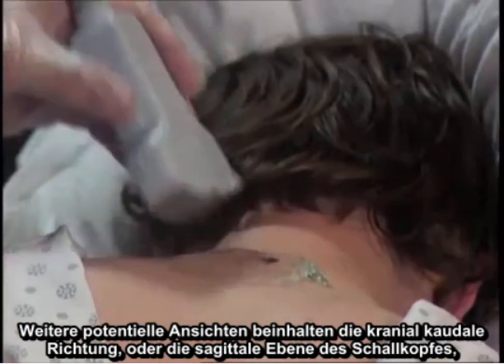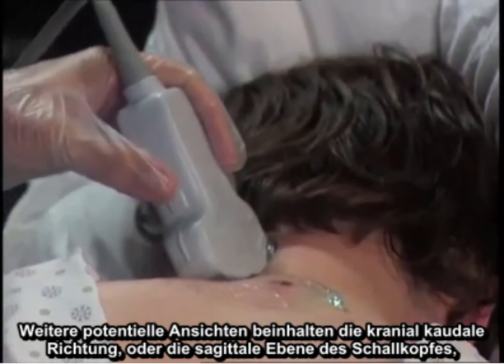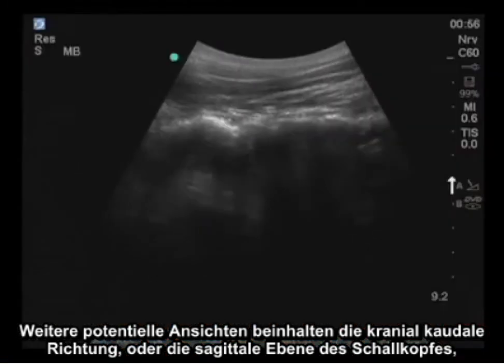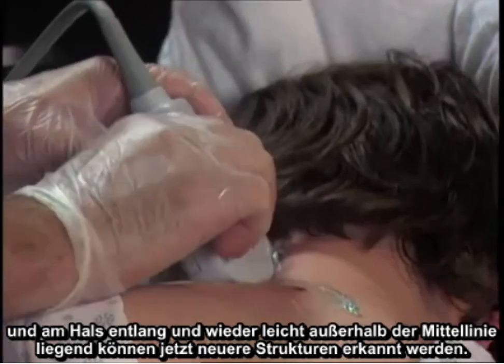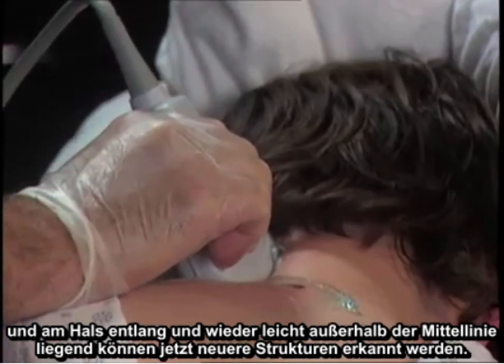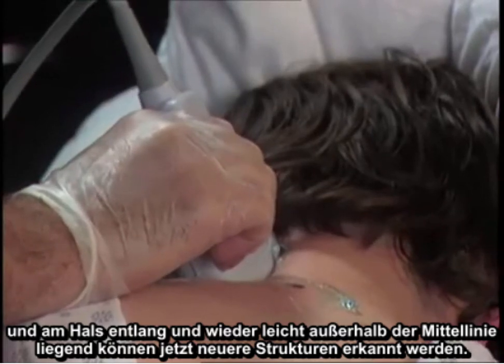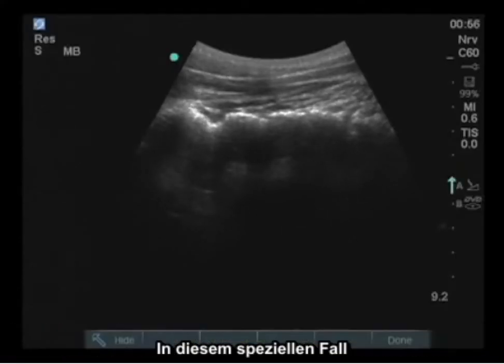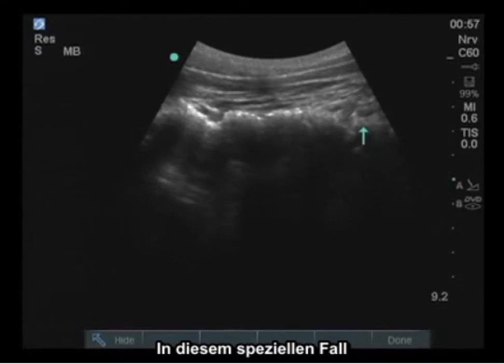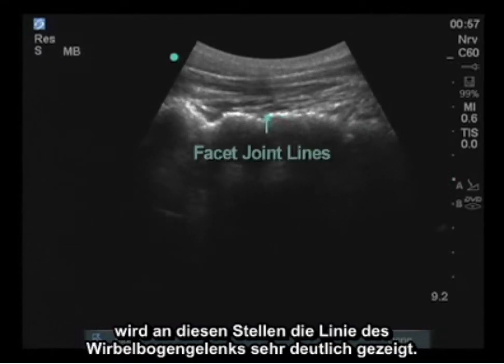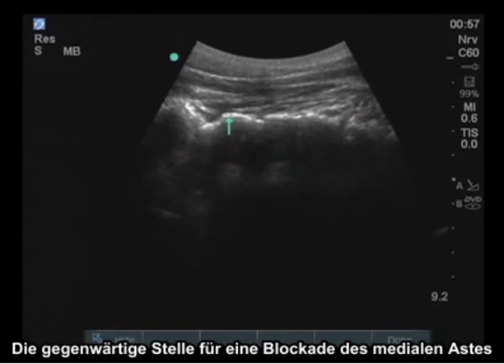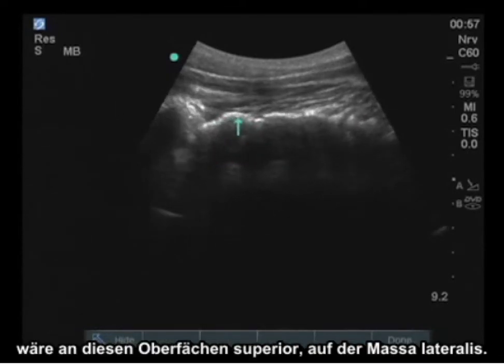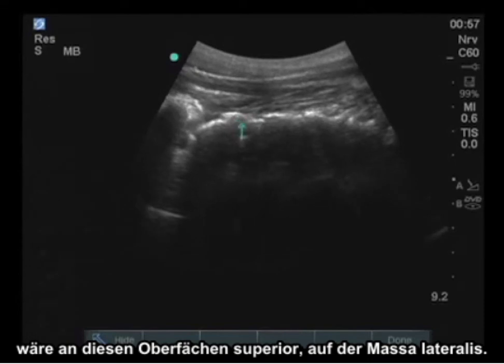Other potential views include the craniocaudate orientation, or sagittal plane of the probe, placed along the neck and slightly off midline. In this particular case, the facet joint line is very clearly indicated at these locations. The actual location for a medial branch block would be on these superior surfaces on the lateral mass.